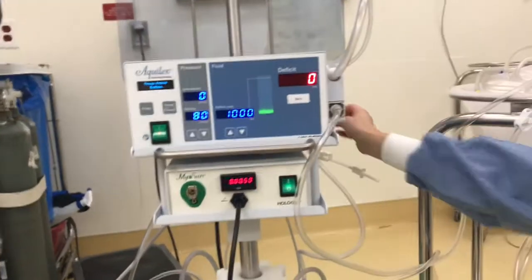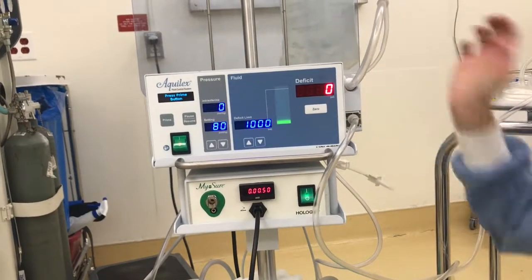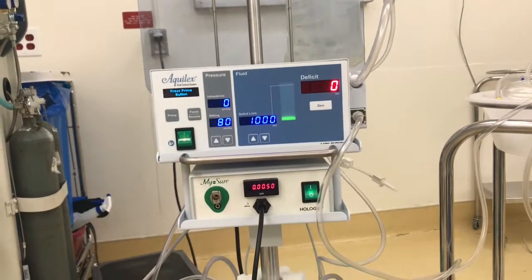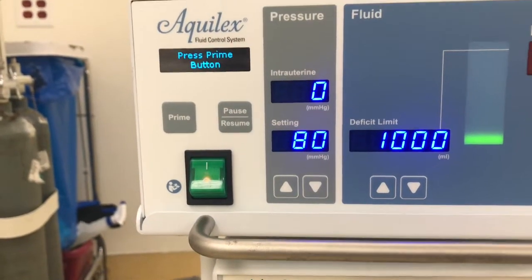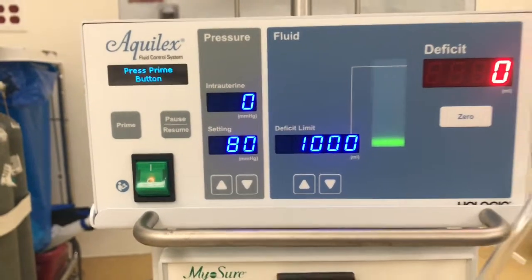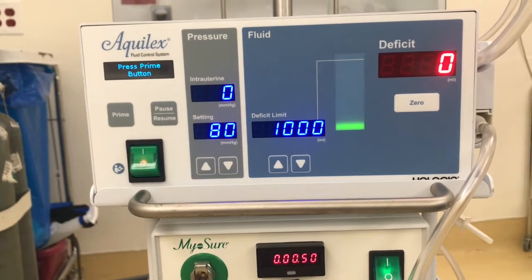Once you have everything connected, you can open up the fluid and then press prime. It'll prime and it'll tell you when calibration is complete. Once it says calibration complete, you can pause it and then make sure you zero it out before starting the procedure.